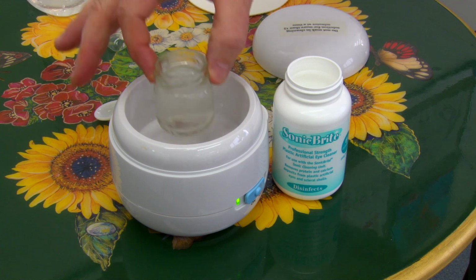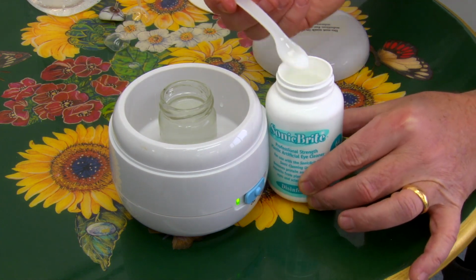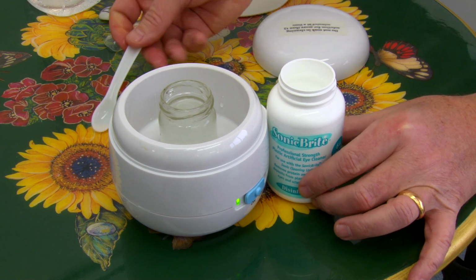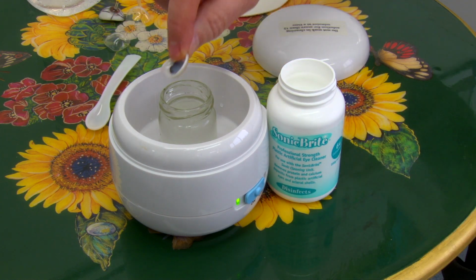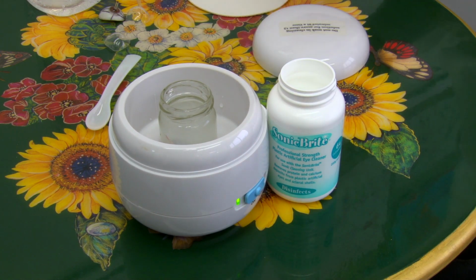This is very good for cleaning artificial eyes. Basically, you put the artificial eye into the ultrasonic cleaner, put a small scoop of the powder with it, and run it for 5 minutes. This will loosen anything that's stuck to the front of the artificial eye.